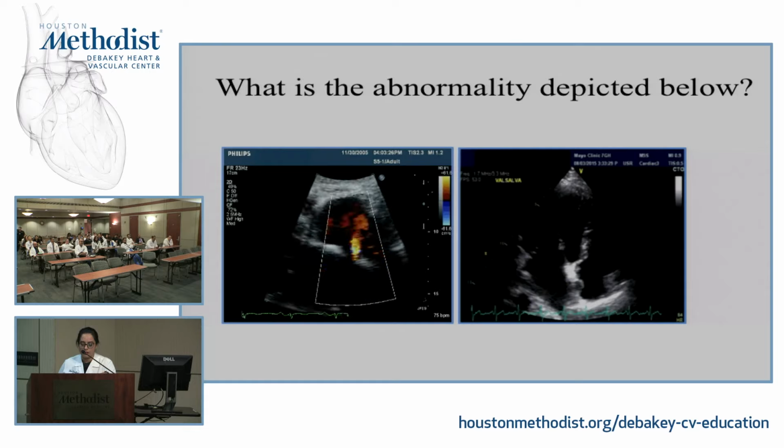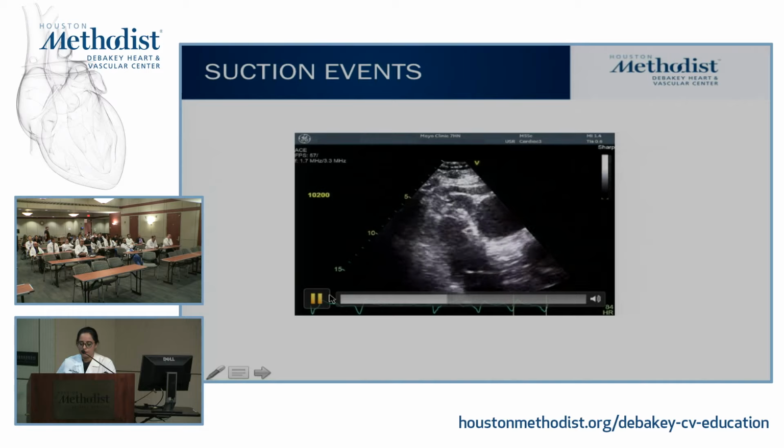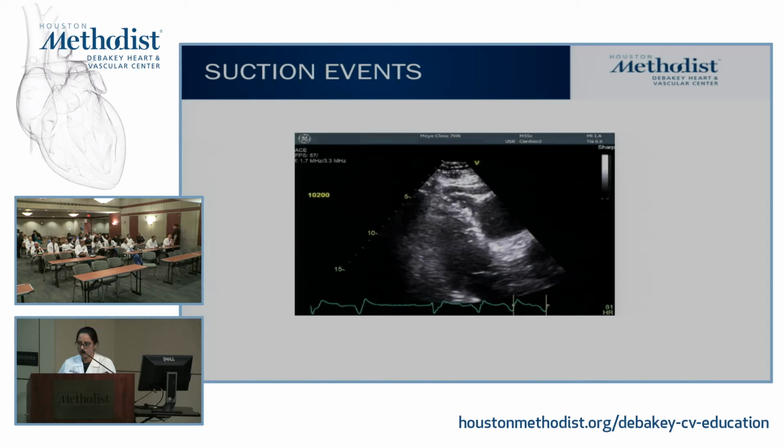This is very common after surgeries. It's not part of the pre-op evaluation. It is, but sometimes it's not evident in some of the echocardiograms earlier on. The mere presence of it is a concern because those hemodynamics will develop after the LVAD. So if present, then the surgeon at the time of the LVAD implantation can close it. Usually that's what they do. And this becomes very evident very quickly. So sometimes even in the OR, the patient hasn't left the OR and they suddenly get hypoxic, so they can fix it right away.